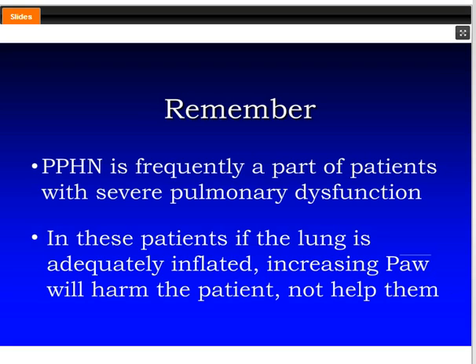I turn my amplitude up to see a chest wiggle, which will typically be about twice the mean airway pressure. Typically, I would never go above twice. So for me, it would be an amplitude of typically 17 to 20 with a mean airway pressure of 10. And I look at the chest, and if I've got a reasonable wiggle at that, I wait until I get a blood gas.